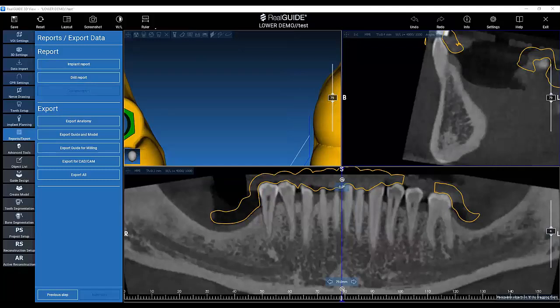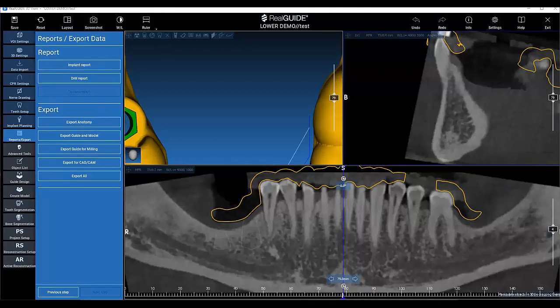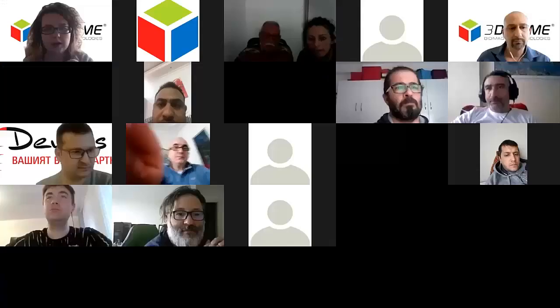So if now I go on the desktop, I think you can't see my screen anymore. Anyway, don't worry, I will show it to you in a moment. Just a moment. Okay, can you see it? I don't know if Ivan can tell me if we continue to see the software.